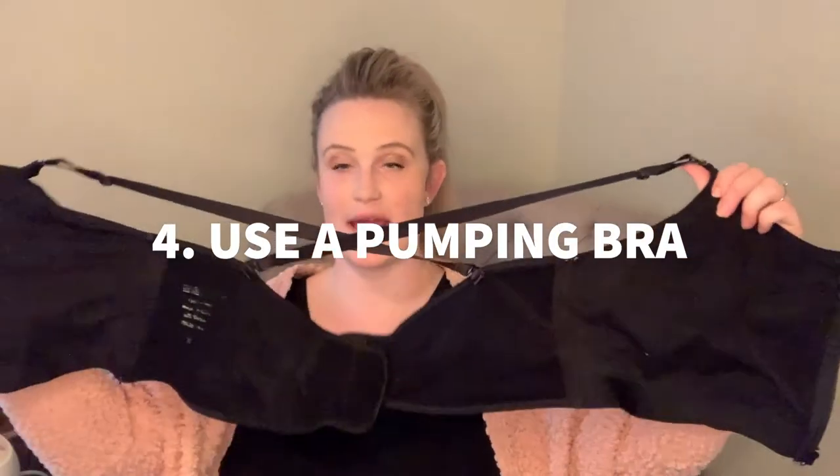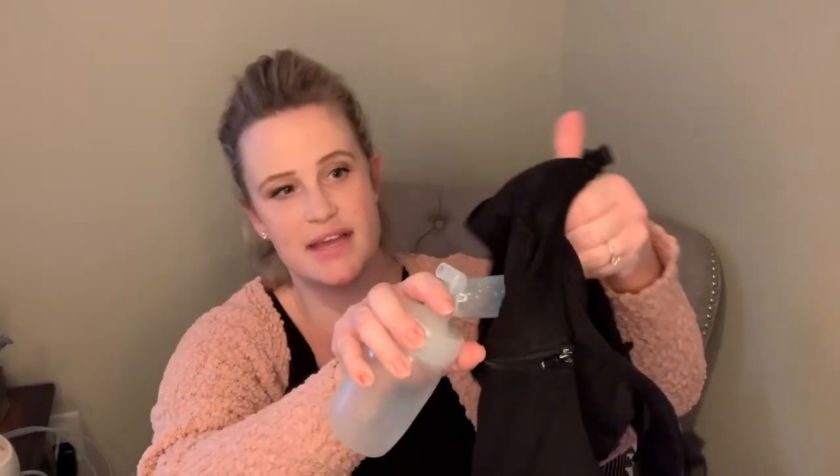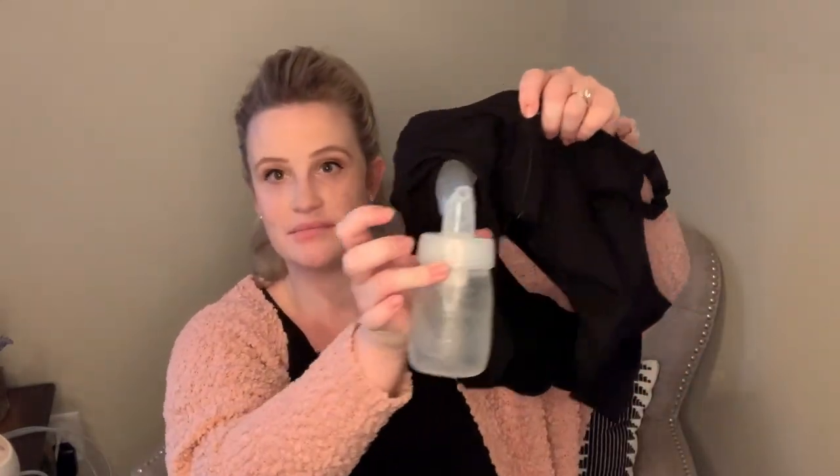Something I'd definitely invest in is a hands-free pumping bra. It has straps and zips up the front, with a hole where you stick your pumping parts through so it holds everything in place. This is awesome because you can have your hands free to take care of your baby, work on your laptop, or whatever you need to do instead of just sitting there holding your pump. I invested in one quickly when I started and it made a huge difference.